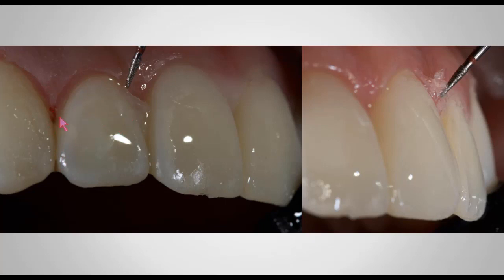If I were to do this on posterior teeth, then on posterior teeth I do open my embrasures a lot more, and I make sure that the patient can get a regular interproximal toothbrush back there when I'm doing full mouth cases and I'm doing prototypes all over the patient's mouth.